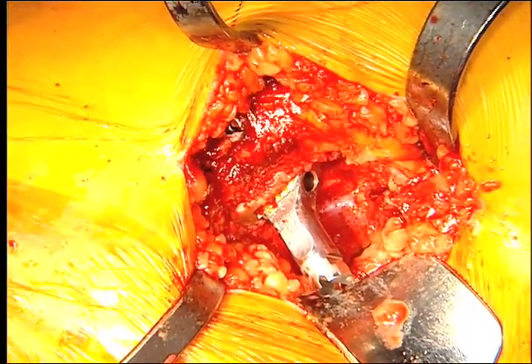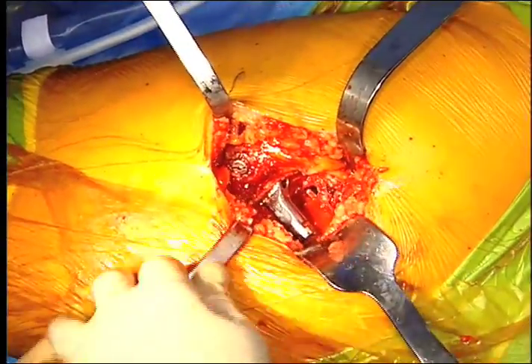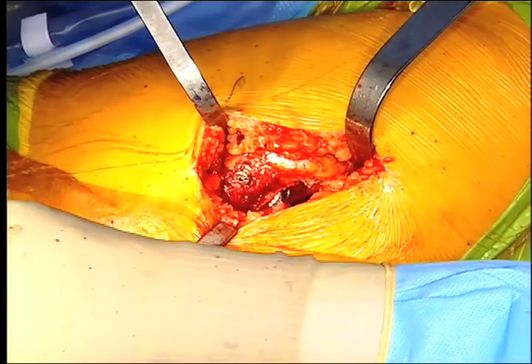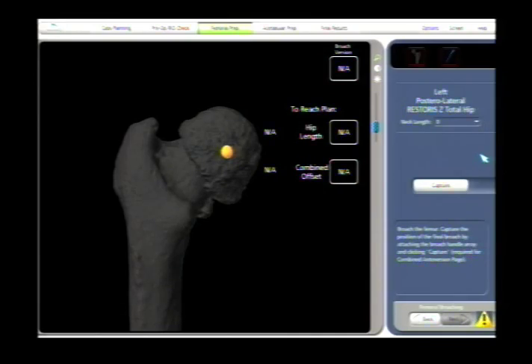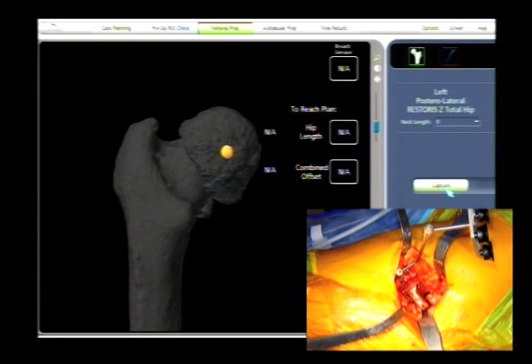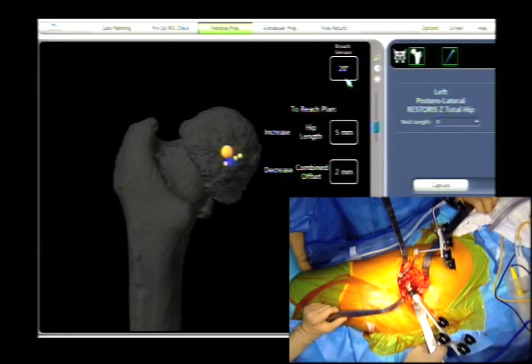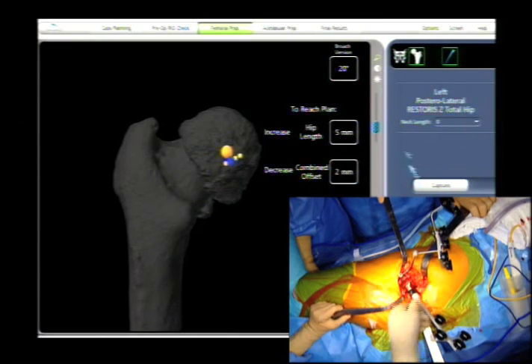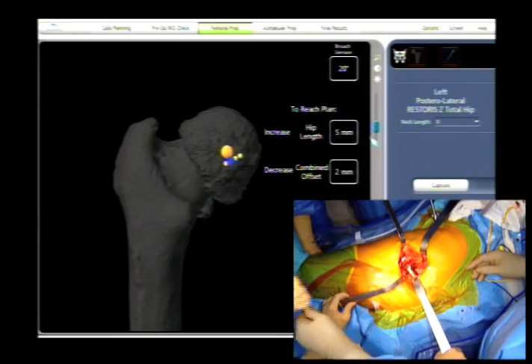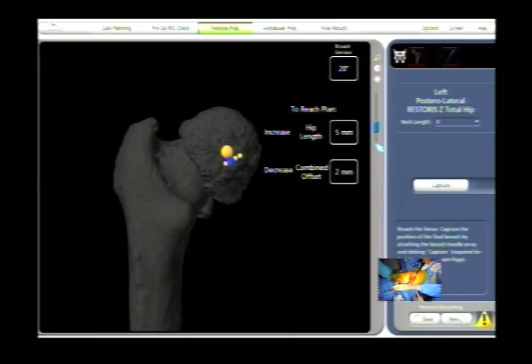Now we'll take the array and the anteversion device to read directly what the anteversion is with the femoral component in. This can differ from what the CT scan read off the medial and lateral epicondyle. The CT scan said the femur had 15 degrees of anteversion — pretty normal. The stem won't necessarily go in at 15. The array reads directly at the camera — and it reads 20 degrees. So it's actually five more than the CT scan. Roger Emerson has noted tapered stems can go in at greater anteversion, and I agree.